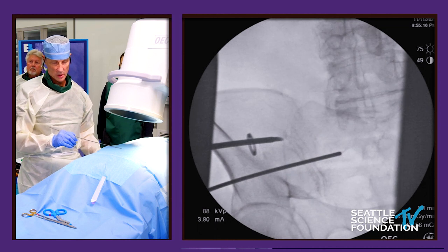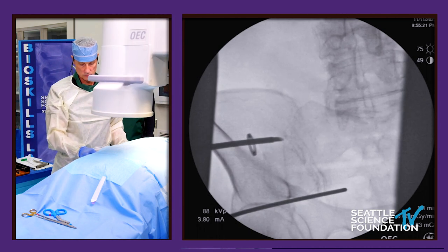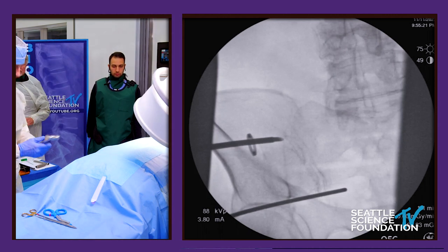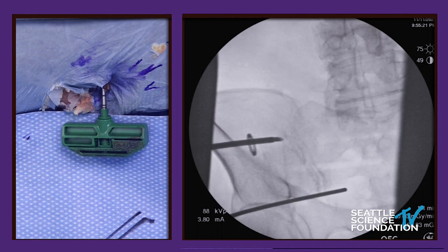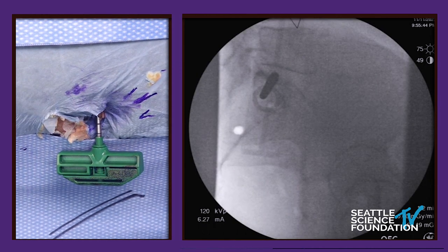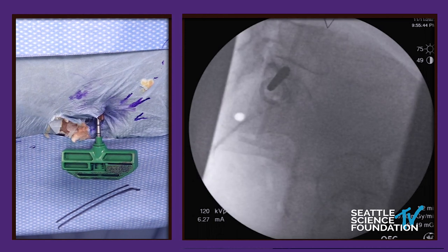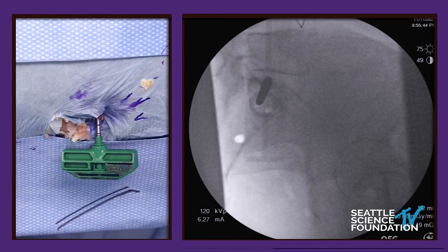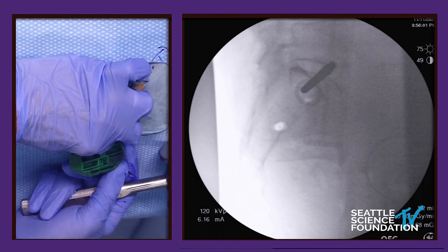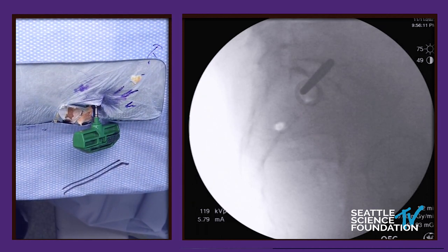You can see the S1 foramen right there, and you can see the S2 foramen right here. Now we're going to switch back to the lateral view. We've got nice targeting — if anything, we might move it a little bit inferior. I can feel a nice resistance right there, so we're headed right smack in the middle of S1. The vestigial disc of S1 and S2 is right below that, and we are going to go ahead and transgress the SI joint.